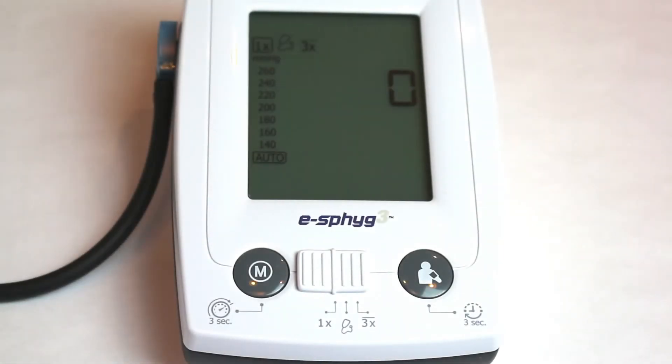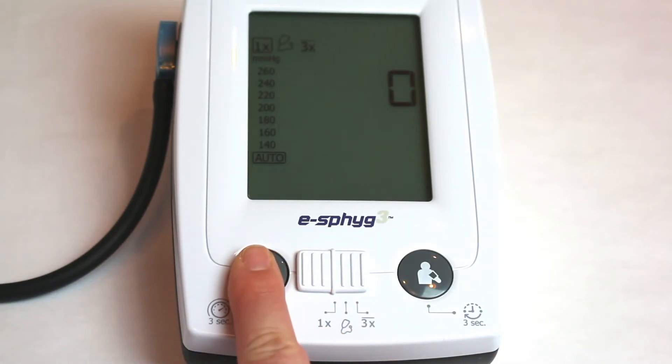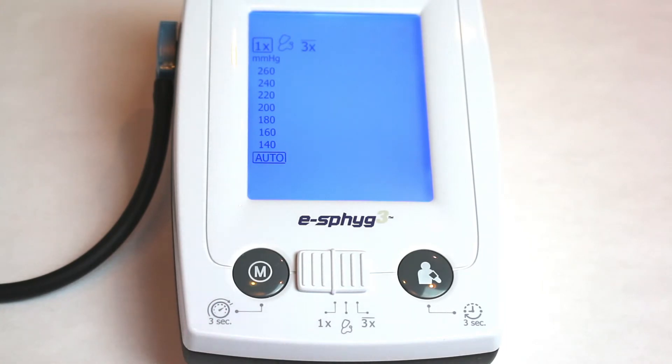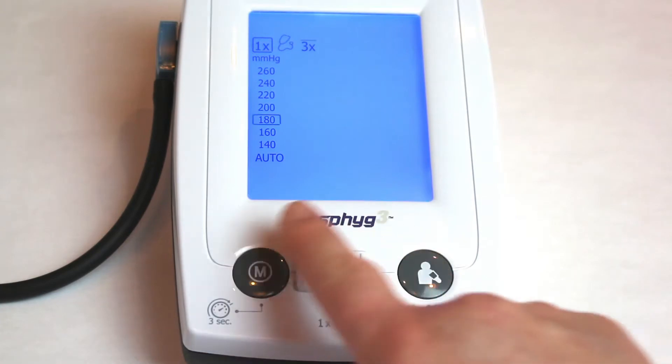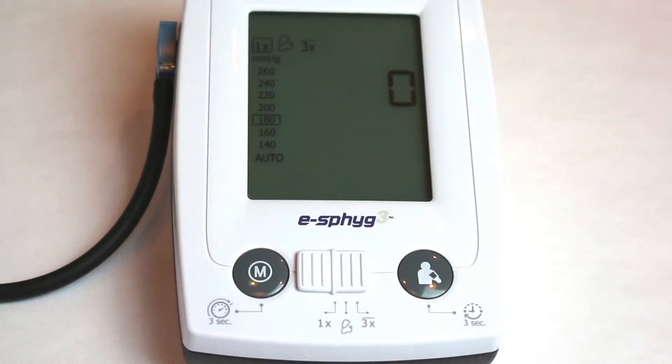If you wish to change the maximum inflation pressure, you can do so now. Press and hold the Memory button for three seconds until the current value begins flashing. Press the Start-Stop button to change the value, then press the Memory button again to confirm the selected value.